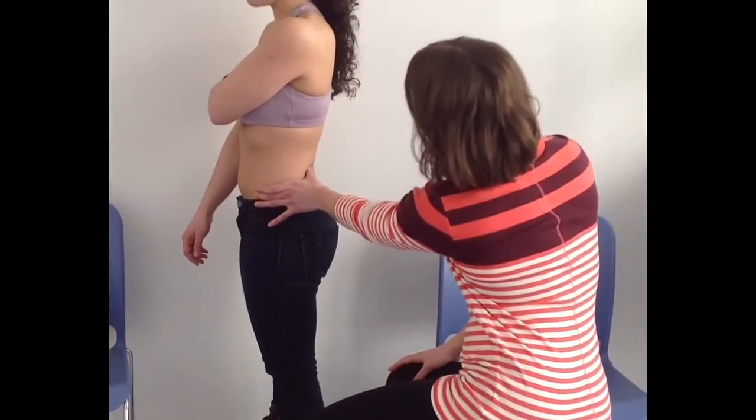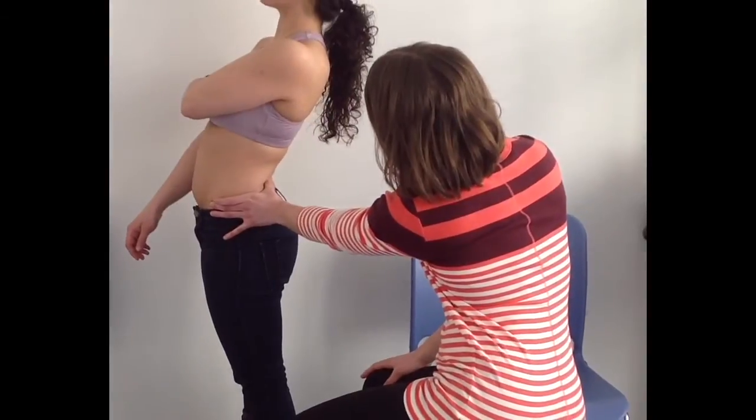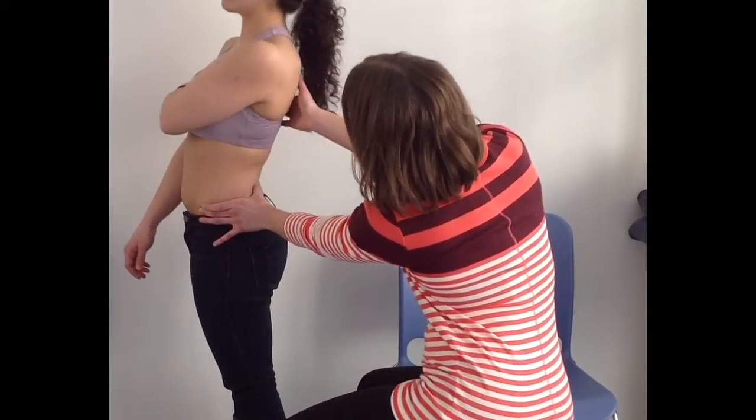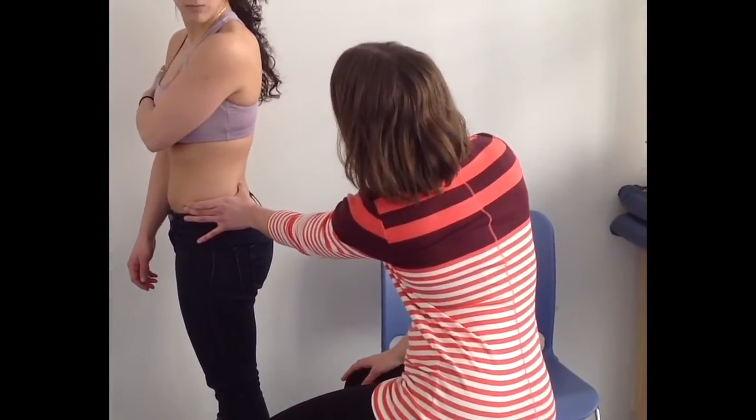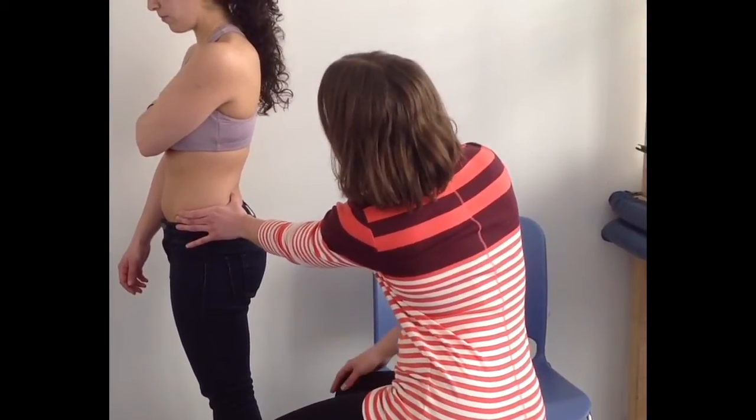Alright, and can I have you bend your back as far as you can? Alright, and then move forward. Was there any pain with that? Okay. Any tingling? Nothing? Okay. Could you bend back for me again?